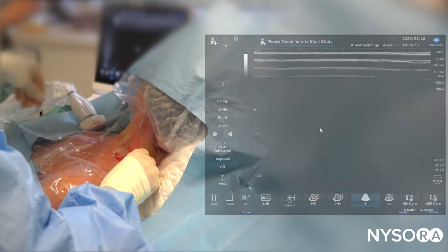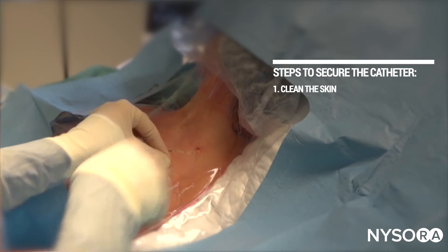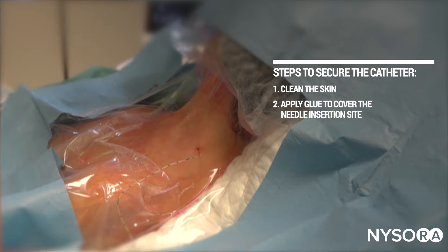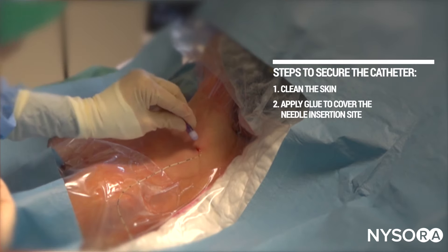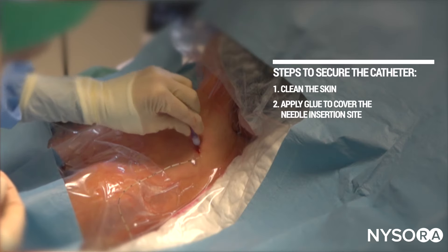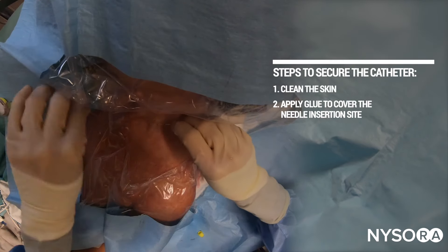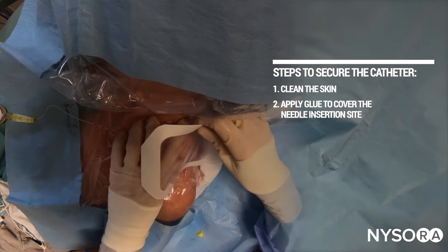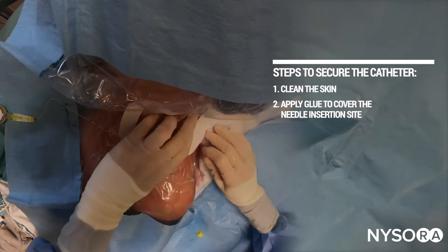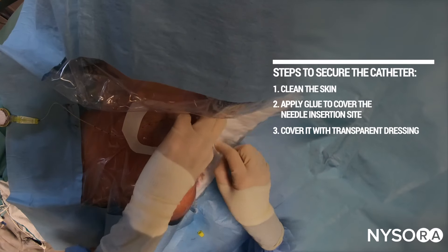That was the procedure; next comes securing the catheter. We're preparing the area with ether. Next comes the application of Dermabond, which we use not to glue the catheter but actually to prevent leakage around the catheter insertion site. The catheter is typically smaller than the needle, so local anesthetic tends to leak outside the interscalene space by tracking alongside the catheter. Application of a little Dermabond or skin glue prevents that. We then apply a large Tegaderm that fixes the catheter in the desired position, preferably away from the site of surgery.